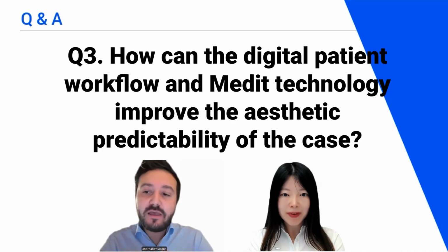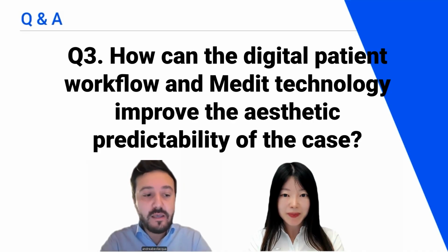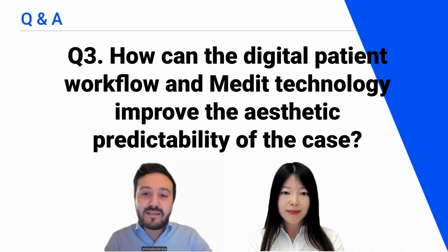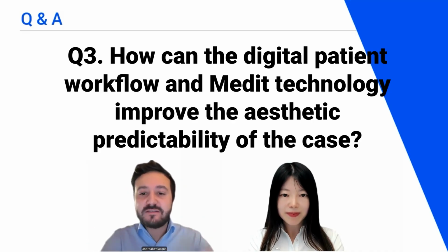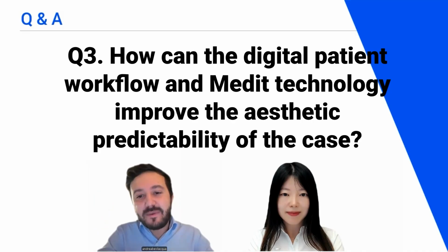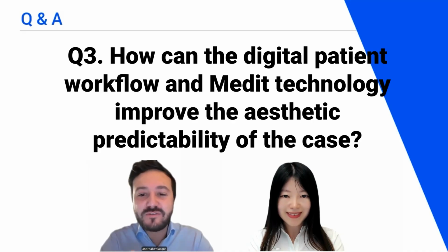Yes, I have an area in my clinic on the fourth floor, a huge area with the angle for the photographs. So I can add photographs in the Medit Link. So the first visit is the name and surname of the patient, and then DP, that is the digital patient. So I save it in the Medit Link like this, and I have every single patient like this. So I can follow up.